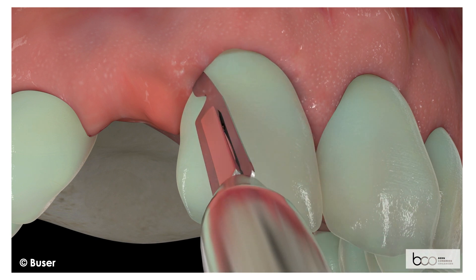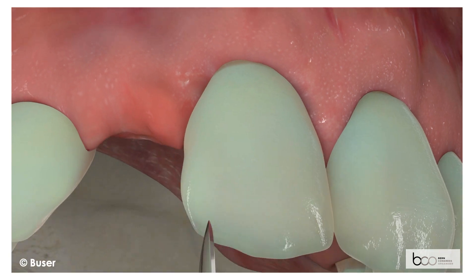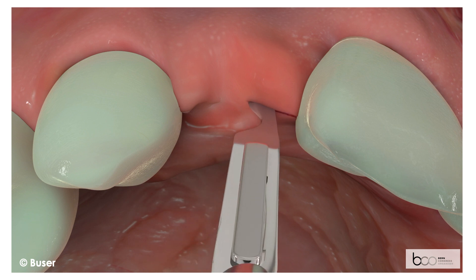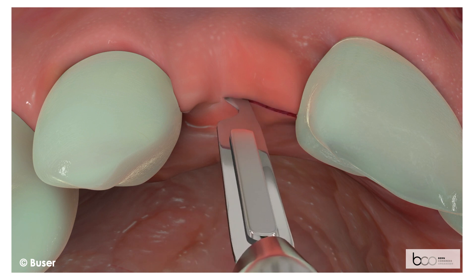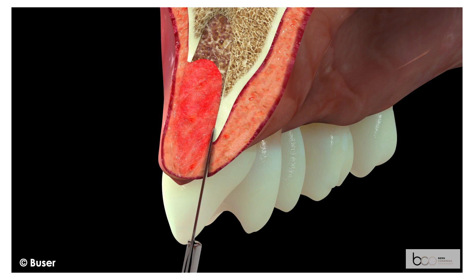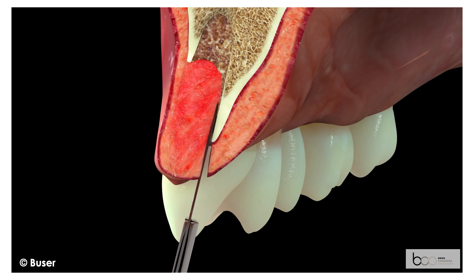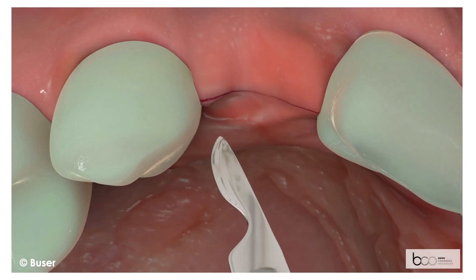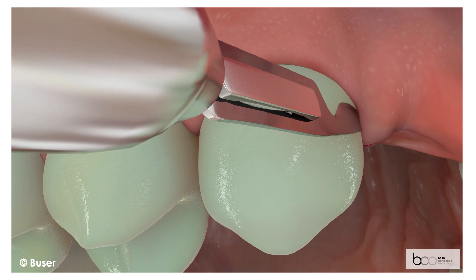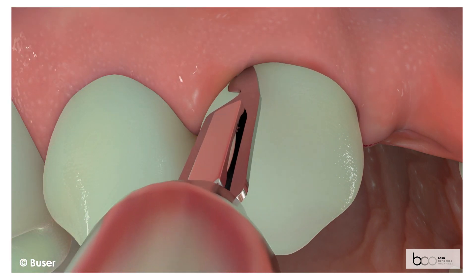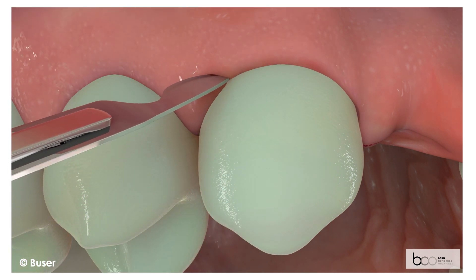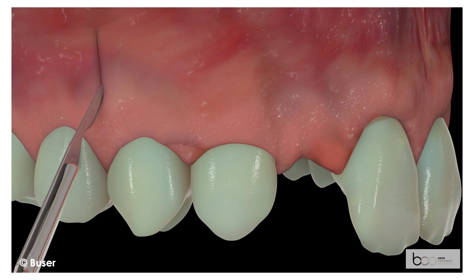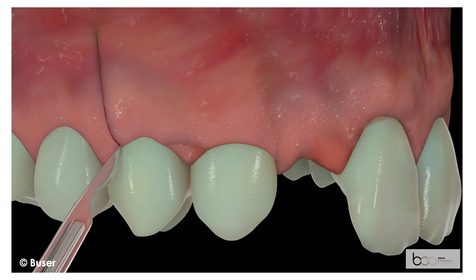Eight weeks post-extraction, implant surgery is initiated with a sulcular incision at the adjacent central incisor, extended in the edentulous area in a slightly palatal position. The blade is inserted deep into the remaining socket along the inner palatal wall. The incision is continued through the sulcus of the adjacent lateral incisor, combined with a papilla base incision and a vertical releasing incision at the first premolar. The result is a triangular flap which offers excellent vascularity and eliminates the risk of a vertical scar within the aesthetic frame.